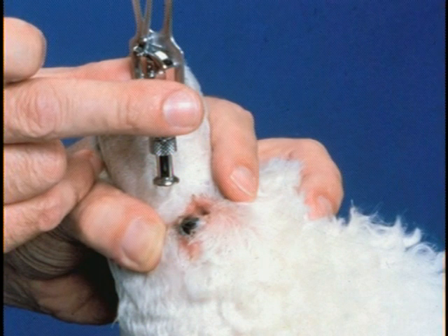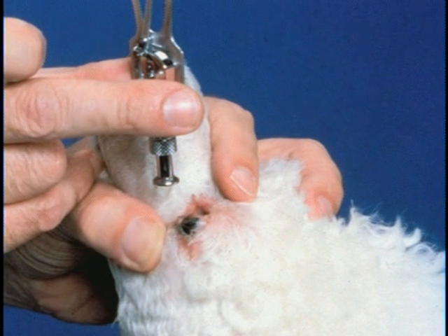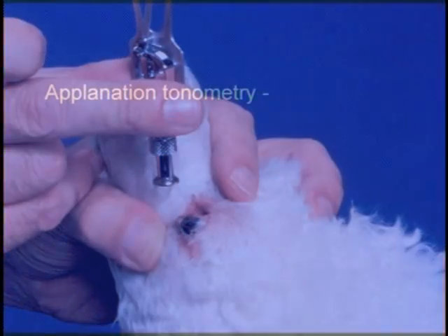This author's clinical experience shows that practices with a Schiotz tonometer either do not use it or do not trust the results obtained. In many instances, pressures obtained by this method are not confirmed on referral to a specialist. The result is that glaucoma is not diagnosed or monitored accurately, and intraocular pressure determination is not performed at the frequency indicated by the breed or clinical signs.